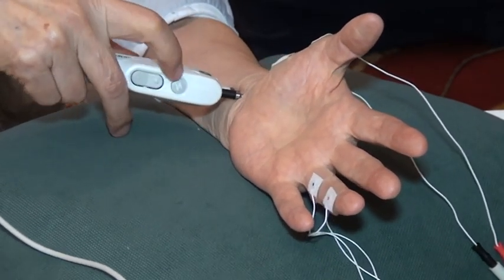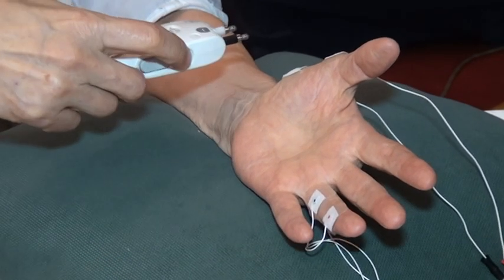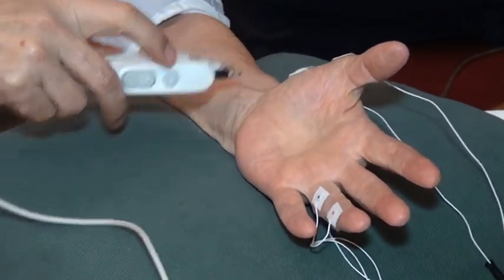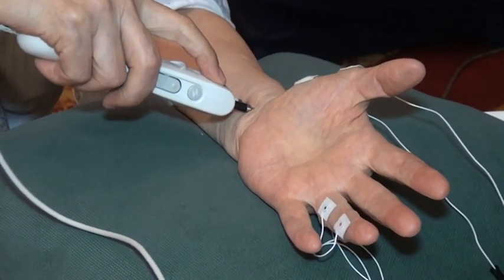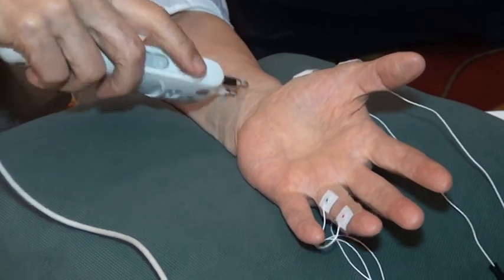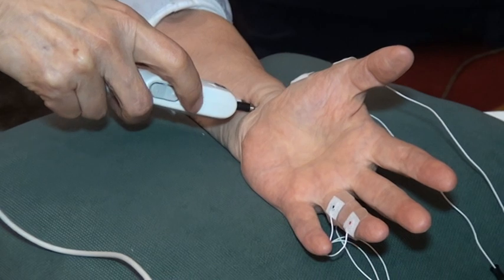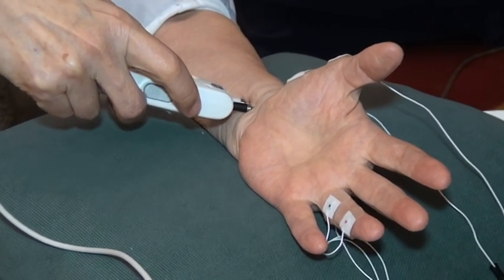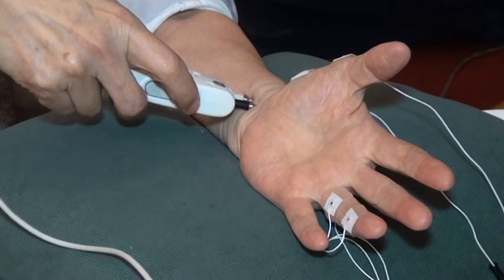So you watch the screen here, and the intensity here, change it to about 15 to speed. I'm going to stimulate, if I can. Now, what did I tell you this morning to do first when I stimulate?